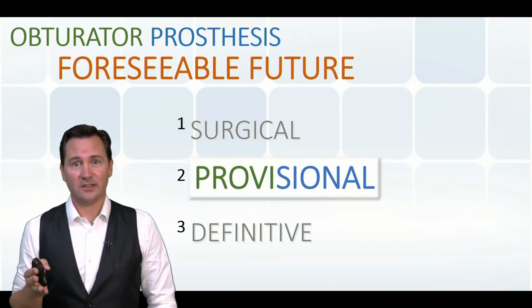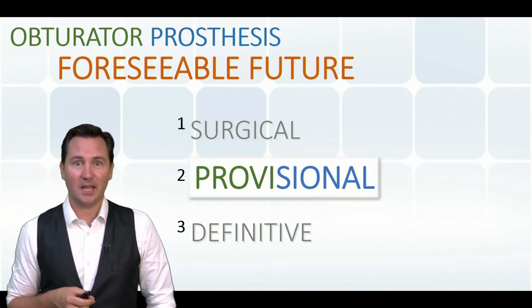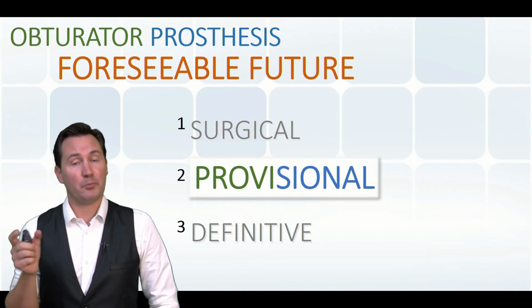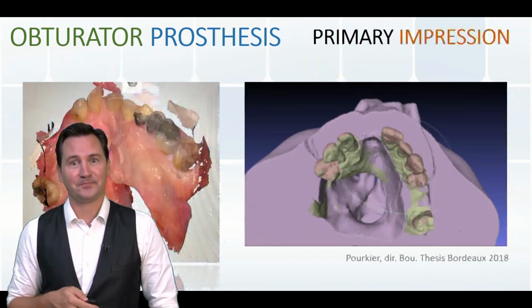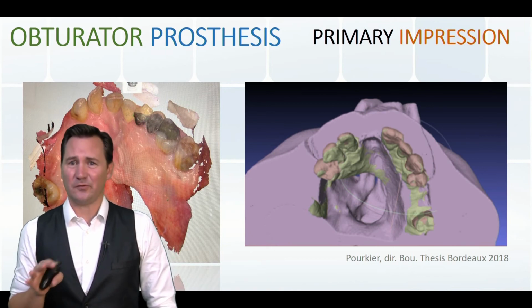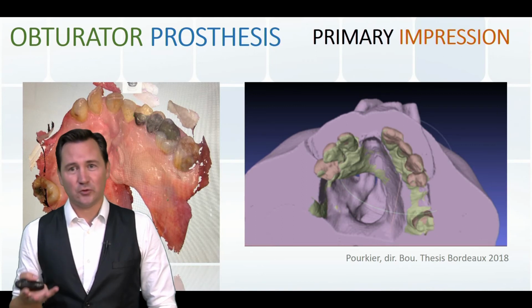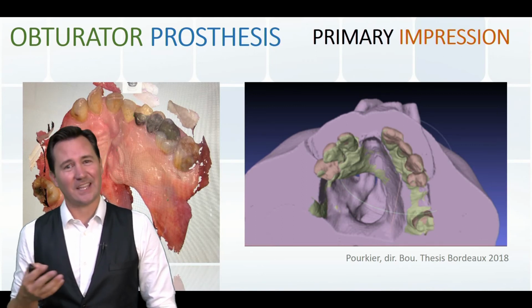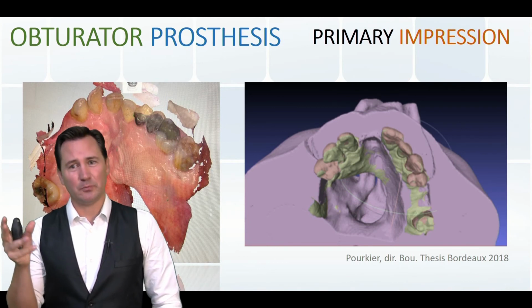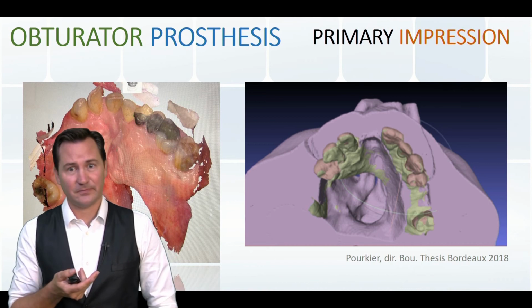After the surgery, some other applications can be facilitated by the use of CAD-CAM. In most of these cases, you need the patient to have gone through a post-surgical imaging. An impression after surgery is really uncomfortable for the patient and stressful for the dentist. A way to decrease pressure is to take an optical impression before surgery. Then you can duplicate it and record only the modified parts.